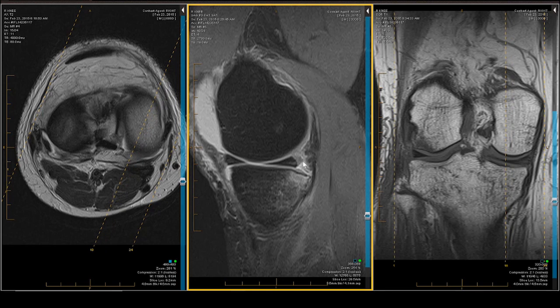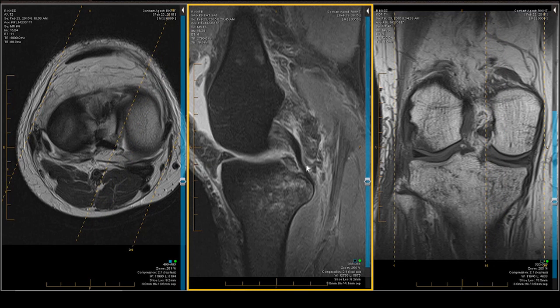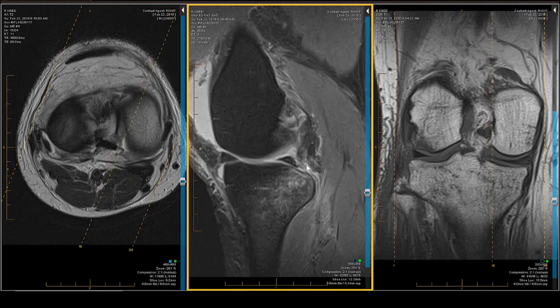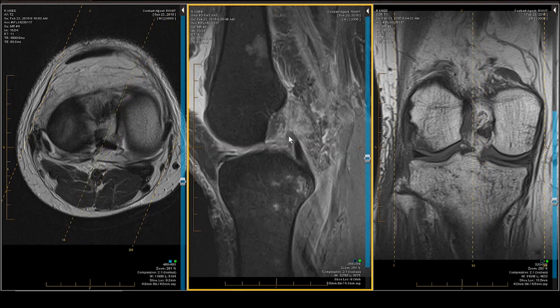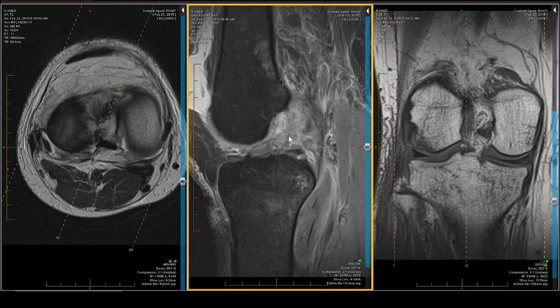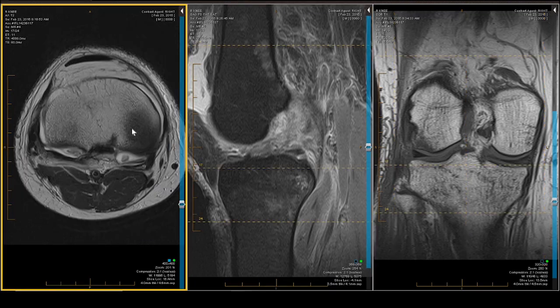As we move off toward the lateral side there's a lot more swelling. Let's focus our discussion there. There is our posterior cruciate ligament. Working our way to the lateral side, there is our demolished, pulverized anterior cruciate ligament, which goes along with our pivot shift injury.